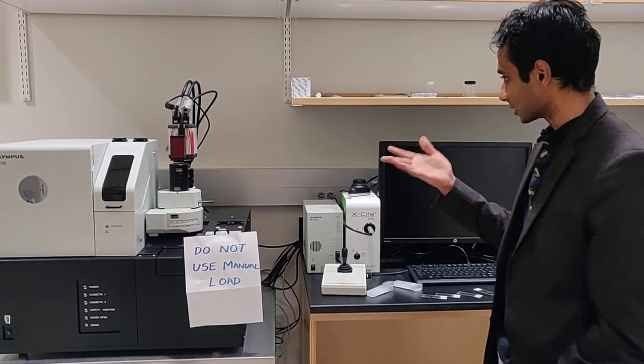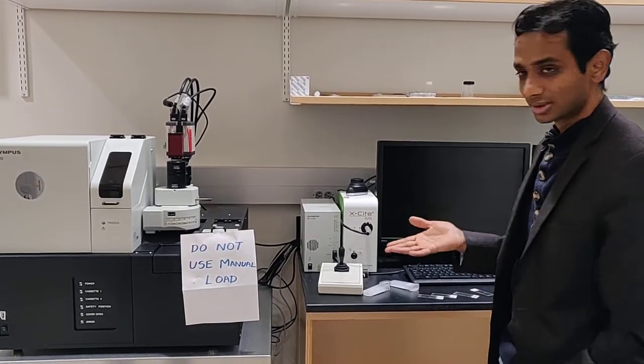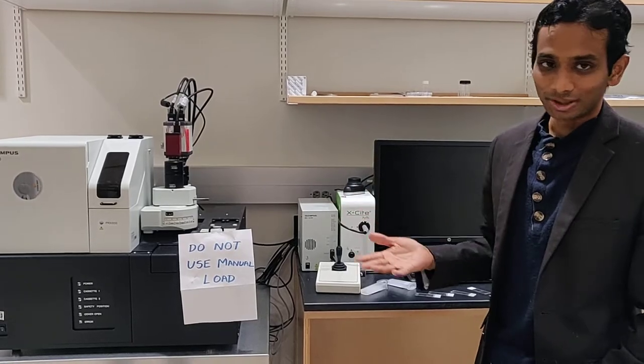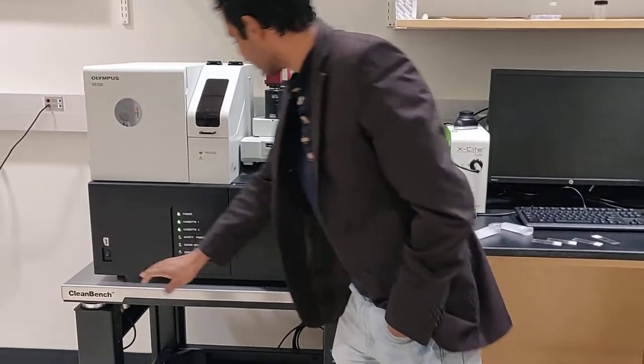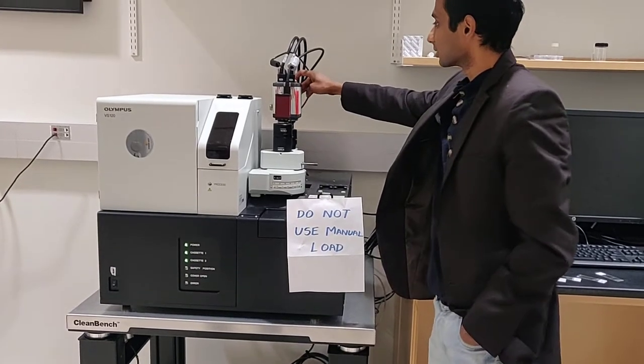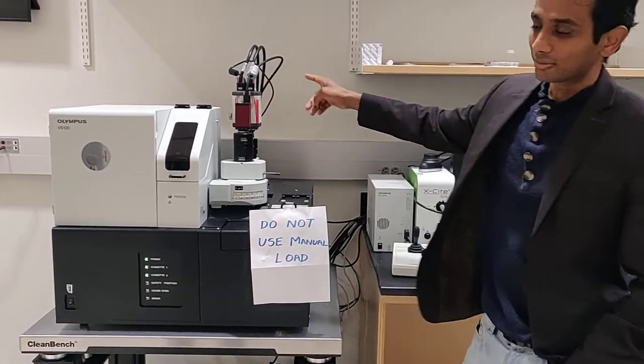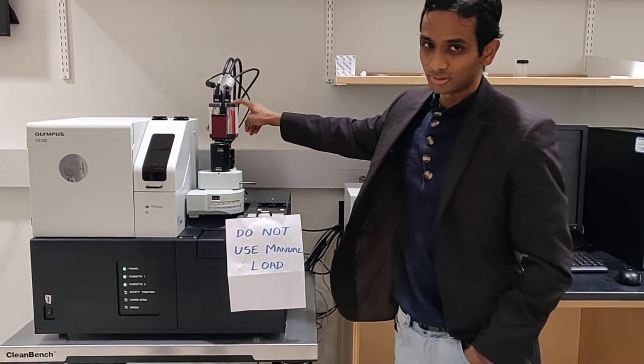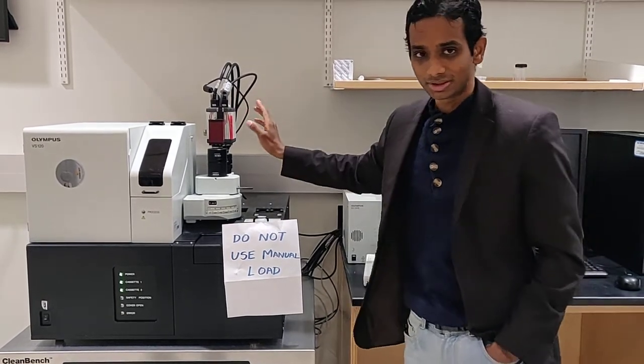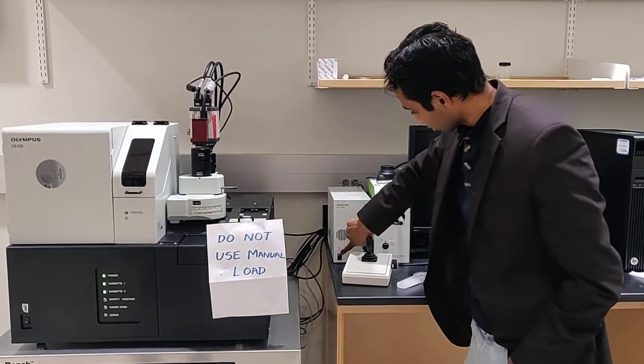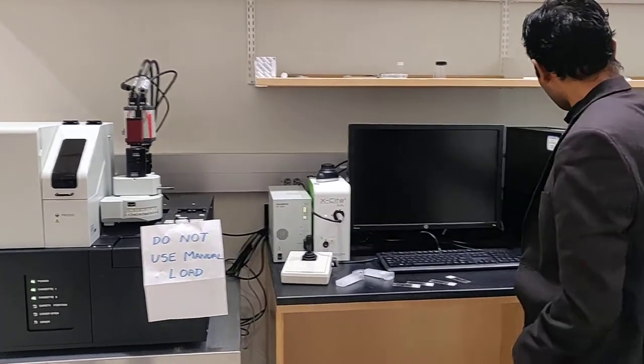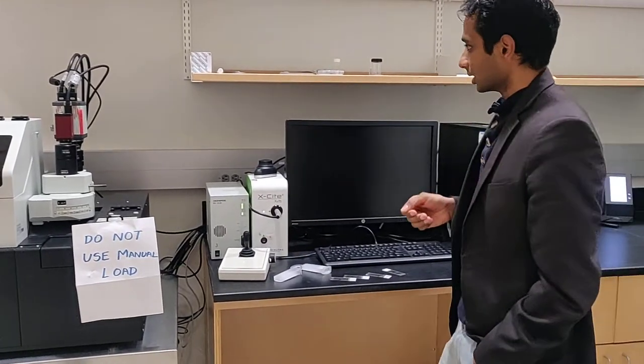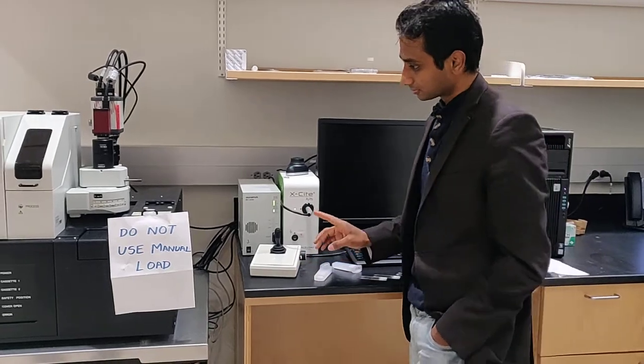To turn on the microscope, it's very simple. Unlike the confocal, there are only five switches. One is here, two is the camera up here. In my video I talked about only turning this on when doing fluorescence, but sometimes it gives errors, so I will turn it on. Three, four, and five. That's about turning on the microscope.